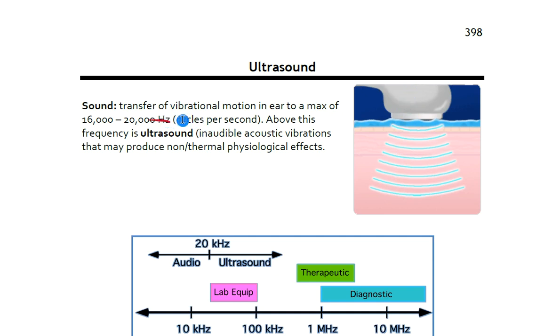One of the terms that you'll need to know is about Hertz. Sometimes it's abbreviated HZ or Hertz is how it also may be documented. But in terms of Hertz, it is the frequency at which these sound waves leave the transducer. So if I said something is 20 Hertz, that means that there would be 20 sound waves leaving per second. So Hertz is per second, cycles per second. CPS is sometimes another way this is described, but typically with Hertz.